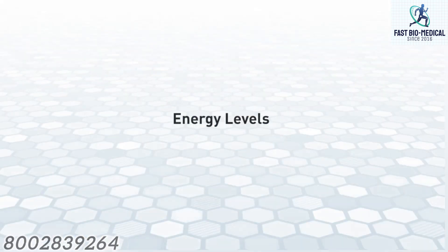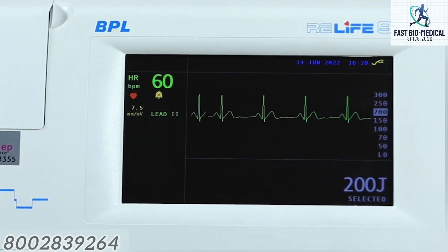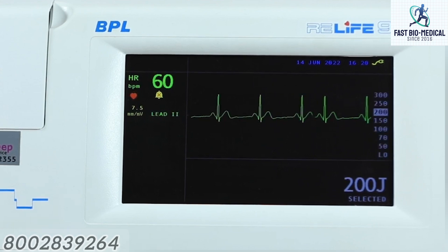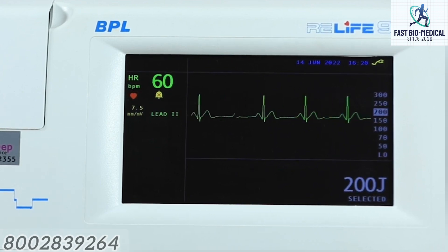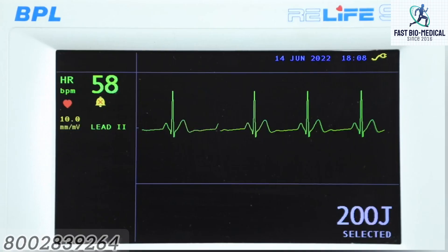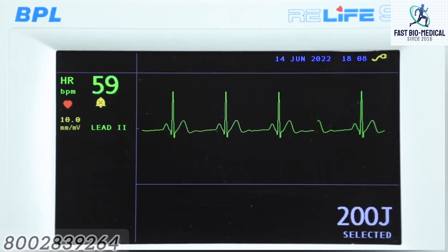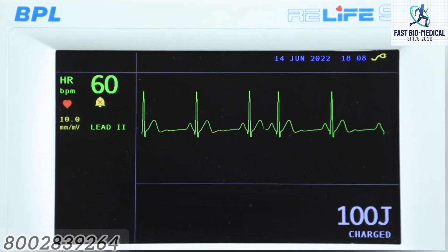Energy levels: this area shows the different energy levels. A menu showing the list of energy levels to be selected is displayed on the right side when the energy up/down keys are pressed. The selected energy level is displayed in bold digits.